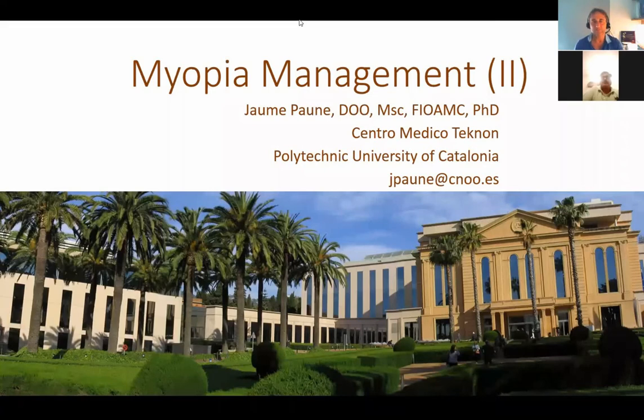Okay. And what would be your call on bifocal soft contact lenses for children for myopia control? Yeah, we mix the names. When we say bifocal soft lenses, they are lenses that have a very clear, definite area for far and area for near. They are very clearly defined. That is bifocal. That could be a design like Biofinity or Proclear, a multifocal center distance design, dominant design.